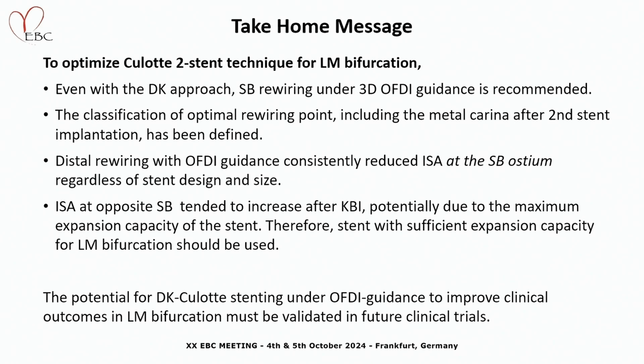The potential for DK culotte stenting under OFDI guidance to improve clinical outcomes in left main bifurcation must be validated in future clinical trials. Thank you very much for your kind attention.